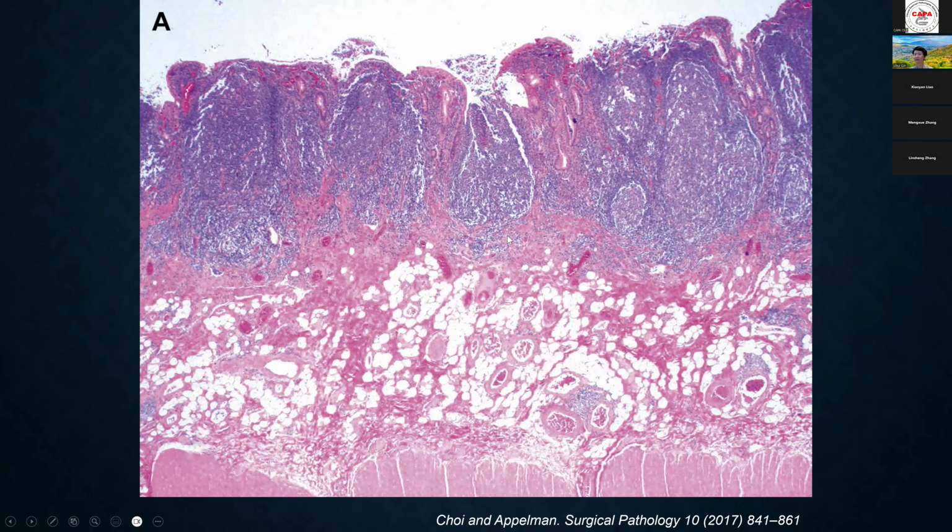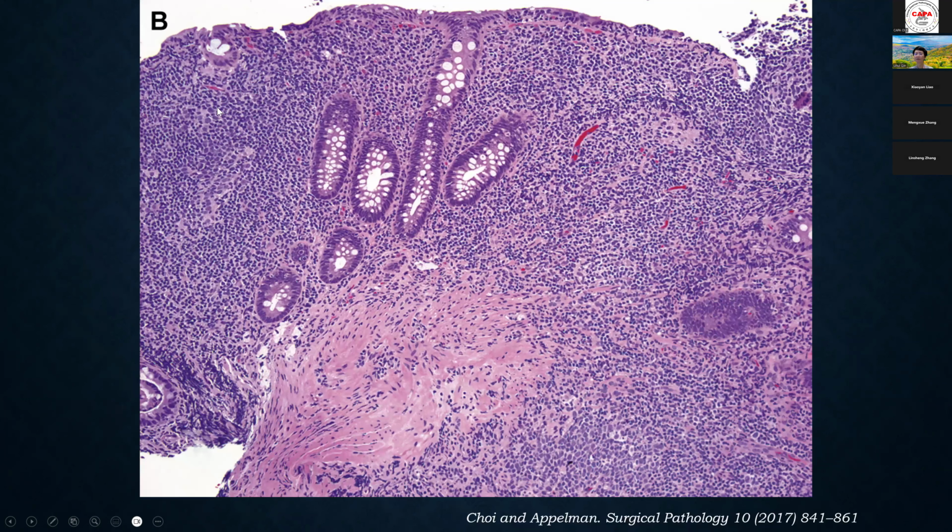They're not diffuse. They're forming lymphoid aggregates. You have a prominent germinal center. So if you look at higher power, they're mostly lymphocytes. You don't see many plasma cells, right? And then the glands actually get pushed by the lymphoid aggregates, but they're not very injured. So this is not IBD.